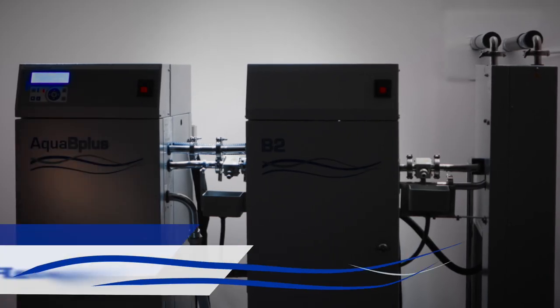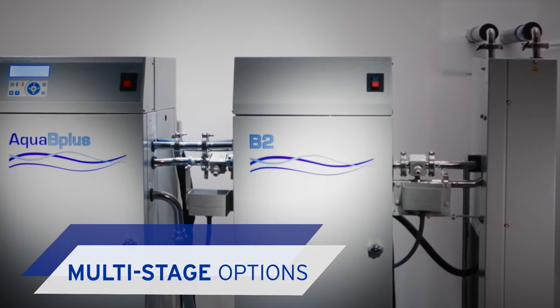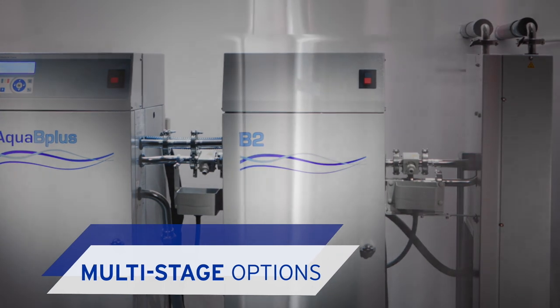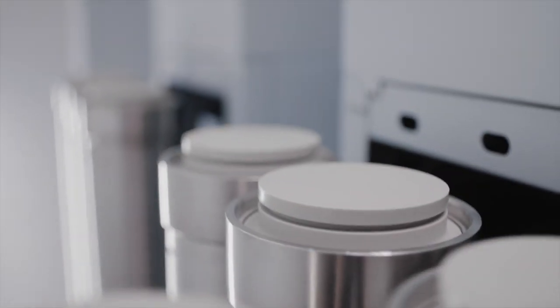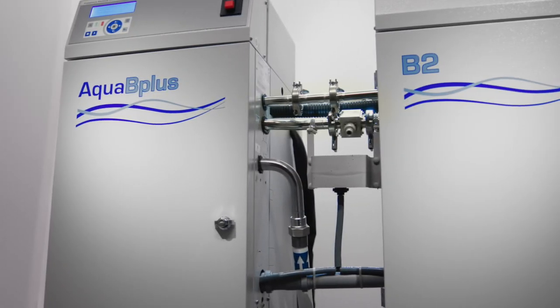The Aqua B Plus is available as a single or double-stage reverse osmosis system, with or without a heat disinfection module. This flexibility helps you meet a wide range of local regulatory and water quality requirements.